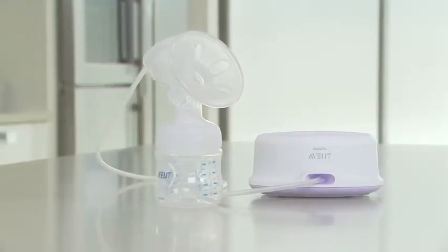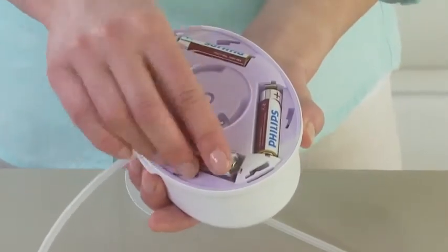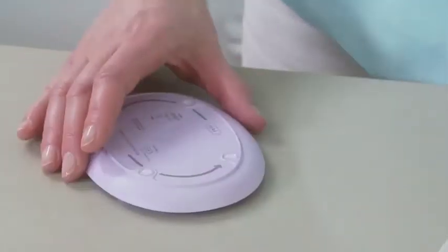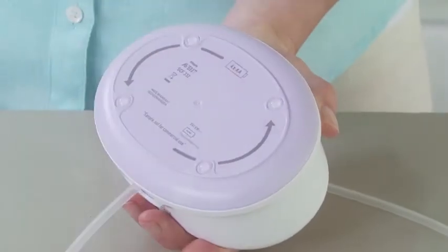The single electric breast pump can also be used with batteries. Turn the bottom of the base unit to open it. A new set of four AA batteries provides up to three hours of operation.